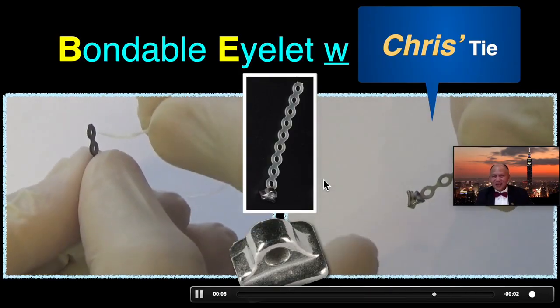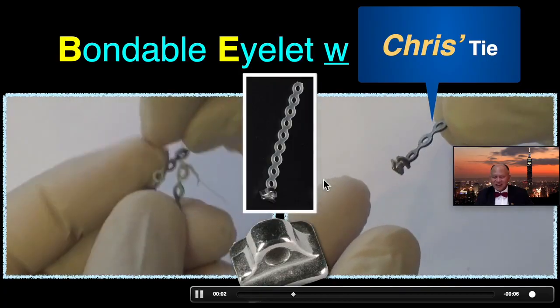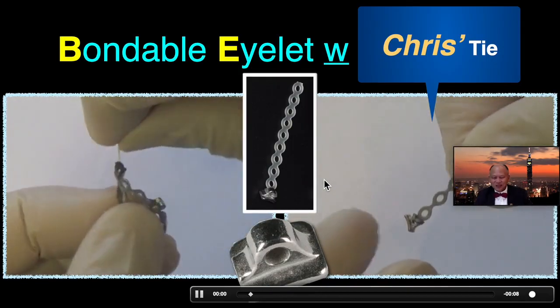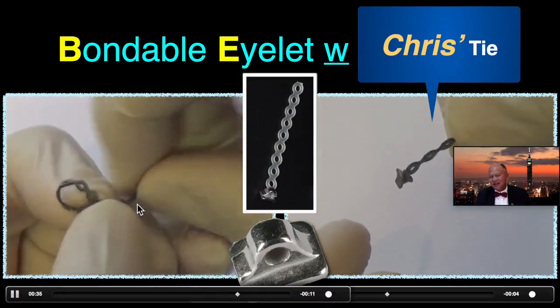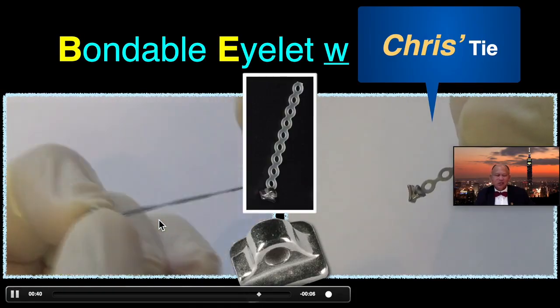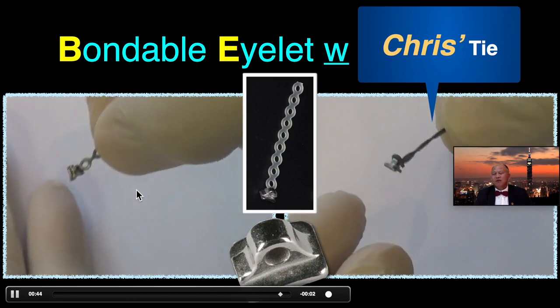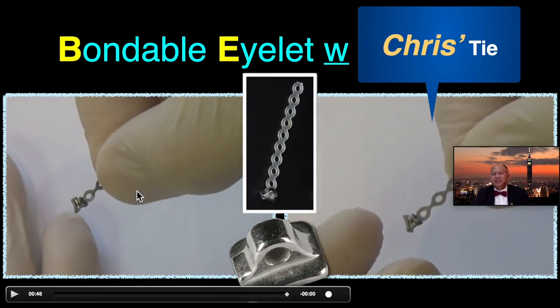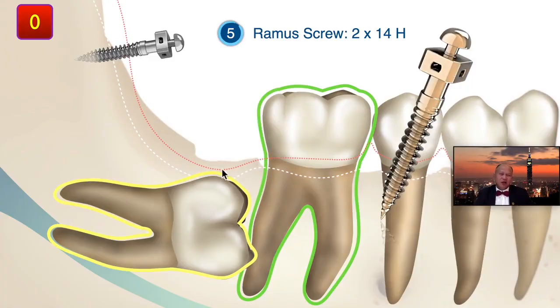It's easy to use dental floss to connect. It's easy to get into this hole, hold the hole right here, and it's just like this. The video will show you the detail. When you look at the video, it's easy, but it's difficult for me to say because I have a language problem. English is difficult.